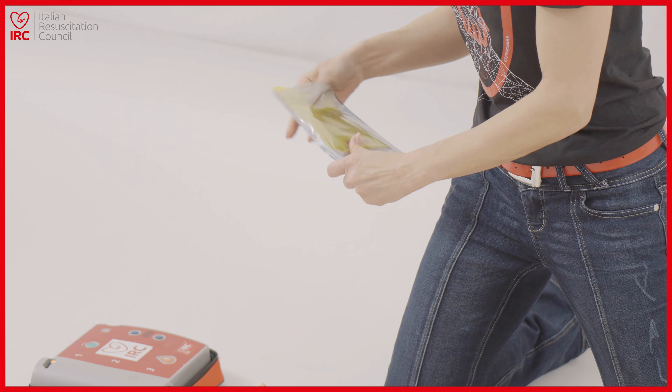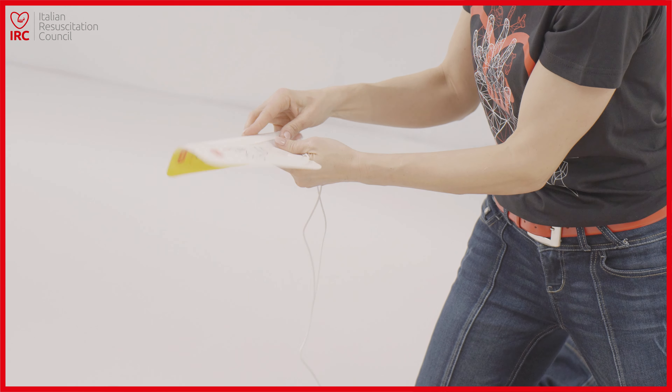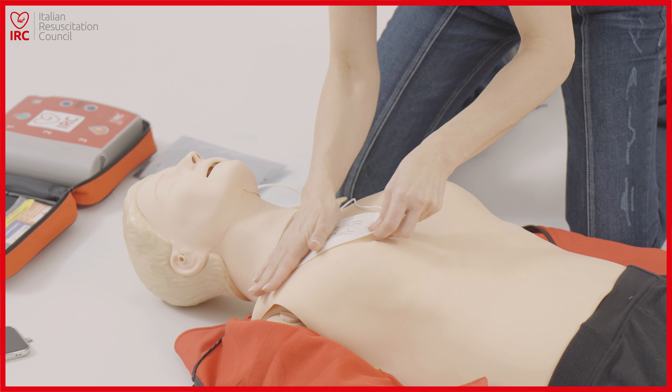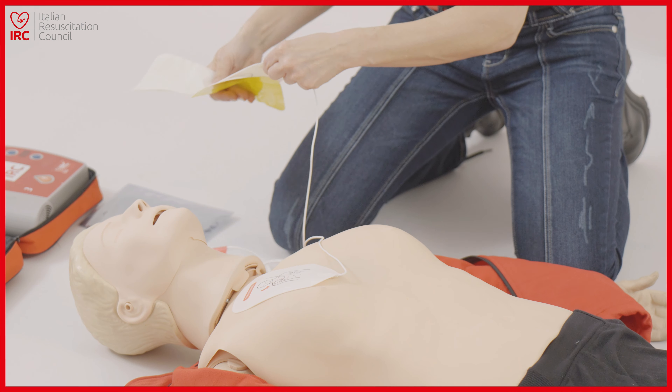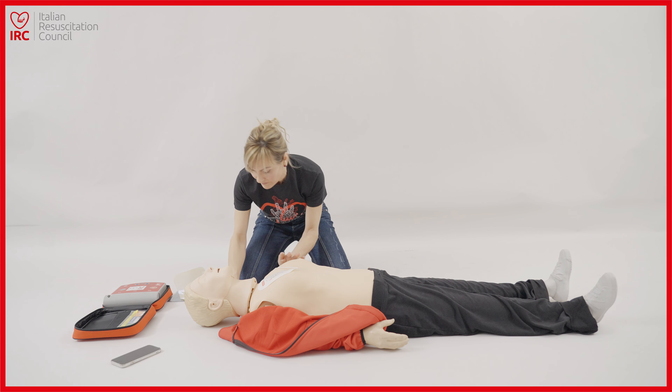Applicare gli elettrodi sul torace. Inserire il connettore degli elettrodi vicino alla spia lampeggiante. Applicare gli elettrodi. Inserire il connettore.